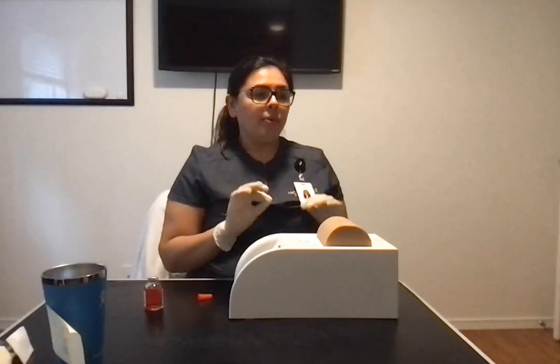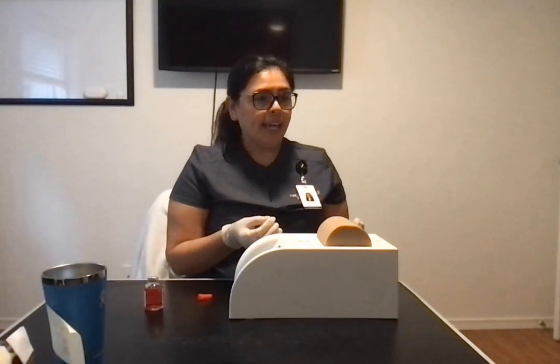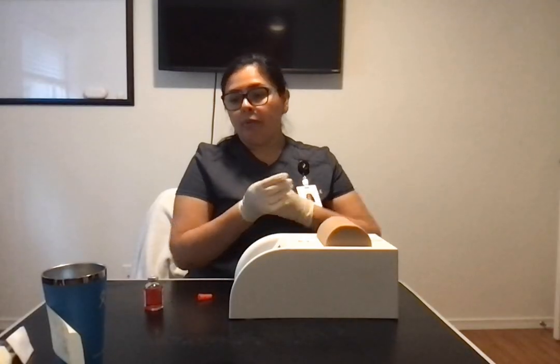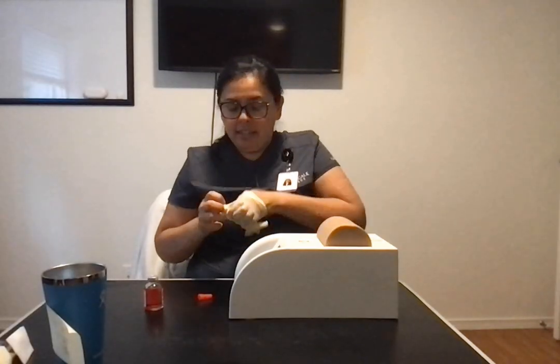At this point, I would ask the patient, are you feeling okay? Is there anything I can get for you? The patient states no, they're feeling okay, they've got no issues. So next I would go ahead and remove my gloves again, perform hand hygiene. I would exit the patient room, closing the door behind me, and then I would go and document the procedure. I would document if the patient had any side effects or any adverse reactions.